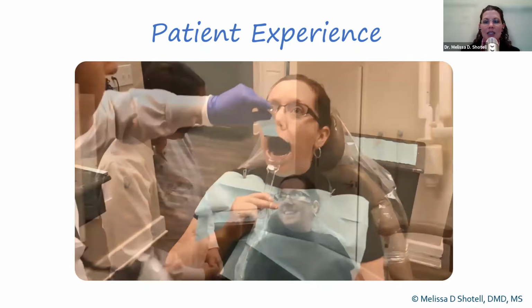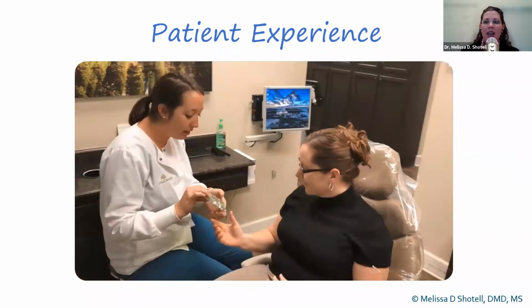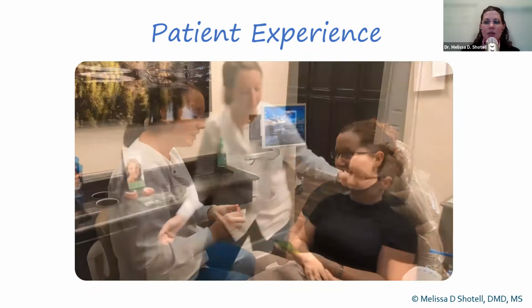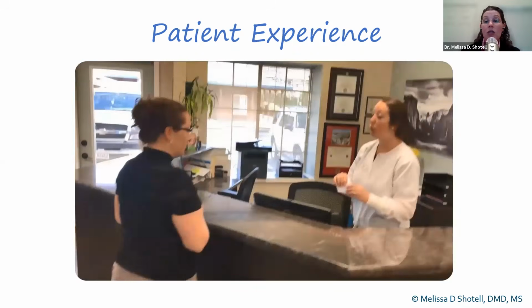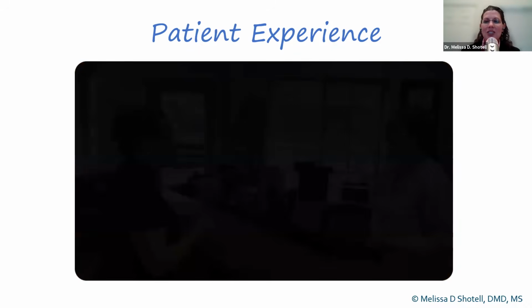My assistant will then take over and she'll take all of the intraoral photos for me. And she'll go through all of the patient education, utilizing some commercially available models that I have in my practice. You can always create custom models for your office as well. And the patient leaves with their next appointment to return quickly for the delivery of their in-office clear aligners.